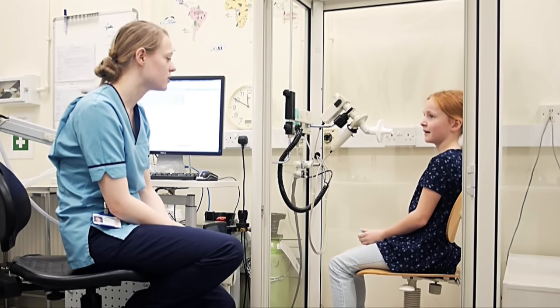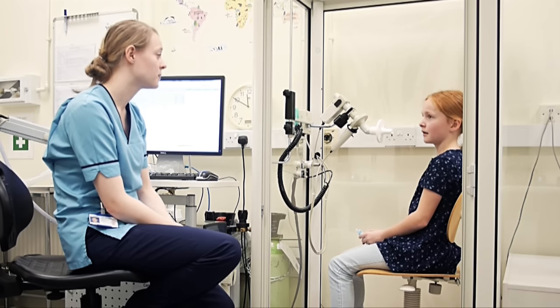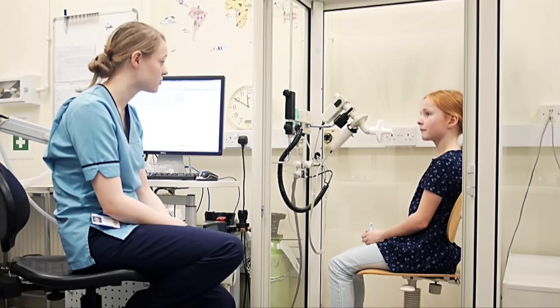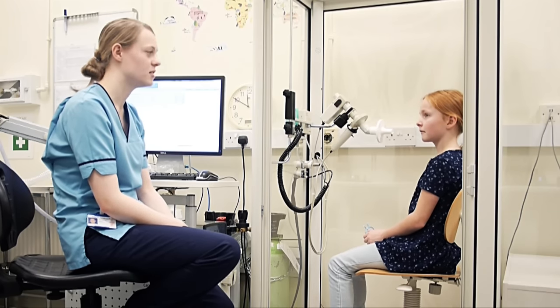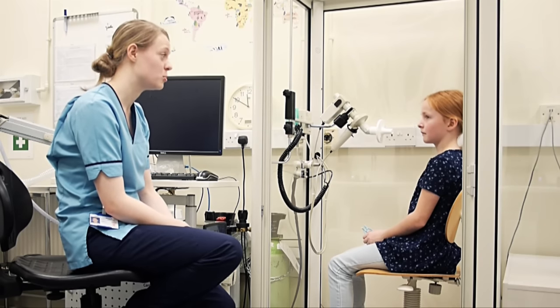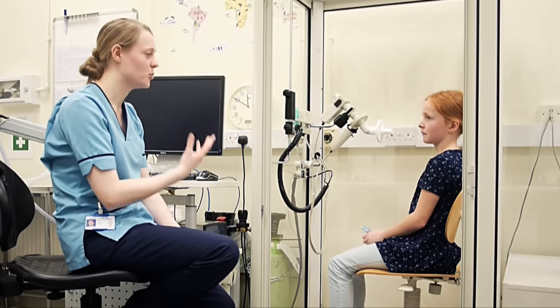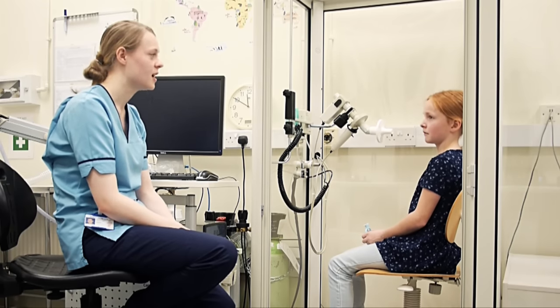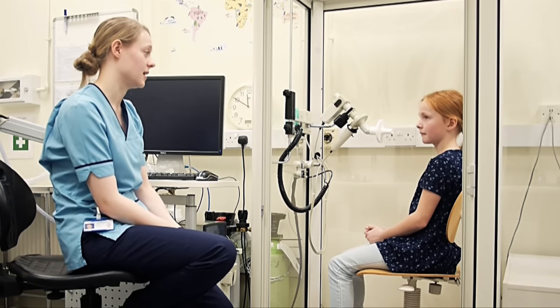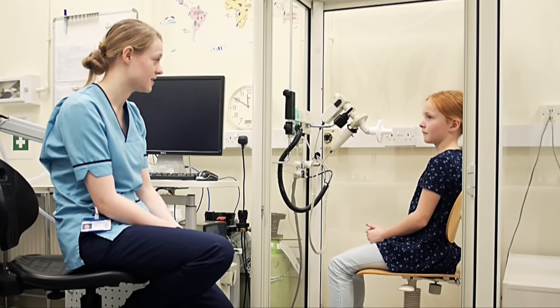Okay, and we'll start off with just nice normal breathing, in and out like you're doing just now. And then once your breathing's nice and steady, I'll tell you that the shutter's going to close, and I want you to carry on breathing just normally, in and out against the shutter, just for about 2 breaths. Okay, then the shutter will lift, and you've got to blow all the way out to empty your lungs, and then do a really big breath all the way in and blow all the way out again to empty those lungs again at the end. And then we can come off and have a rest.